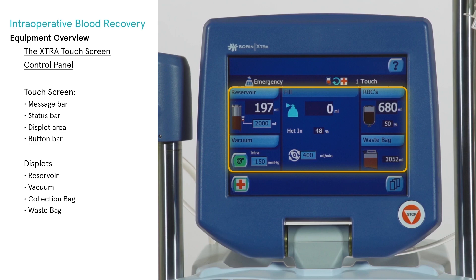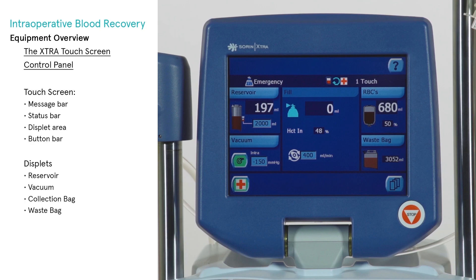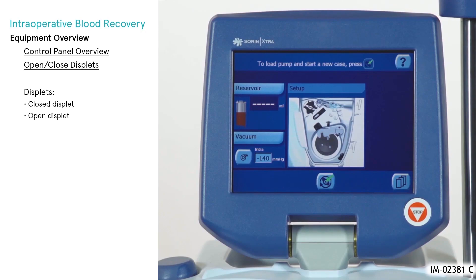The Extra ATS is controlled primarily through displets, or display applets, which may be independently opened or closed as needed. The organization of the displets matches the spatial location of the various components of the auto-transfusion system: reservoir, vacuum, collection bag, and waste bag.